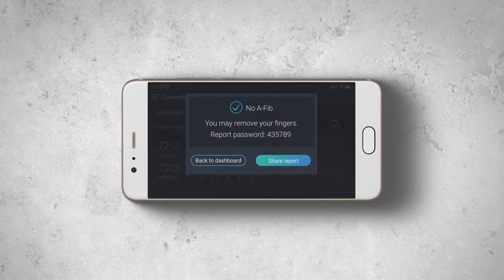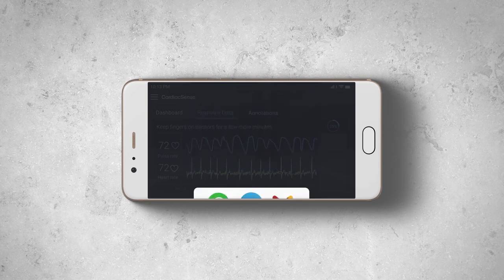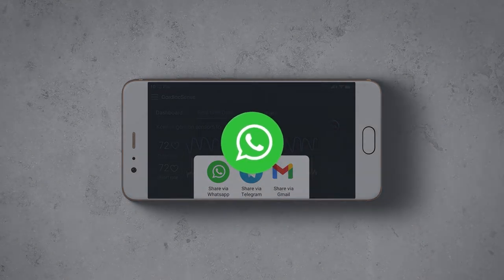An event report is generated. When the report is ready, you can select to share the report with your physician or anyone else you choose by tapping the share report button and sharing with any third-party app you have on your phone.